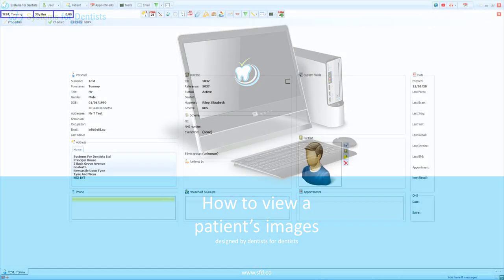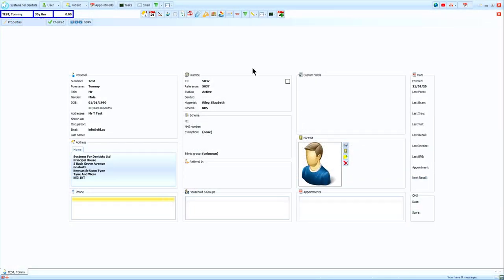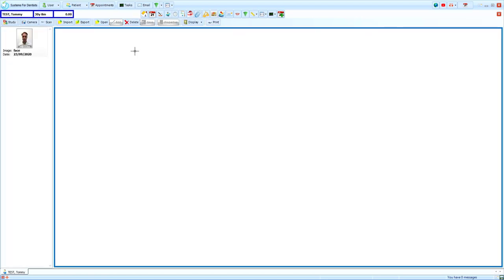From the patient record, select the images button from the second row of icons at the top of the screen. With our patient image screen open, you will now see a new row of buttons.